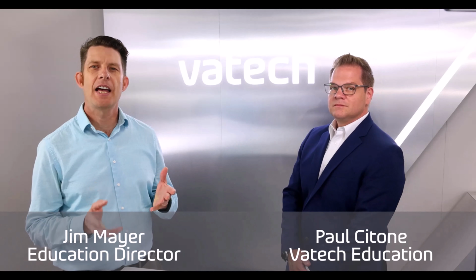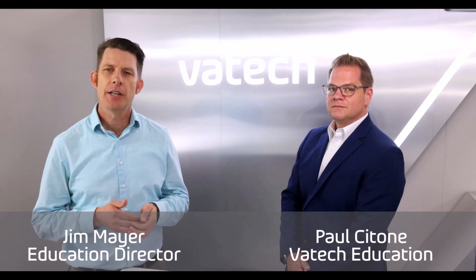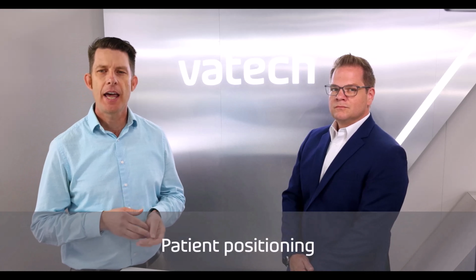Welcome to your Vatech Education experience. At the conclusion of today's sessions, you will understand the available modes for your new Vatech device, be able to accurately position patients, resulting in high-quality images, and also efficiently navigate the Vatech software.